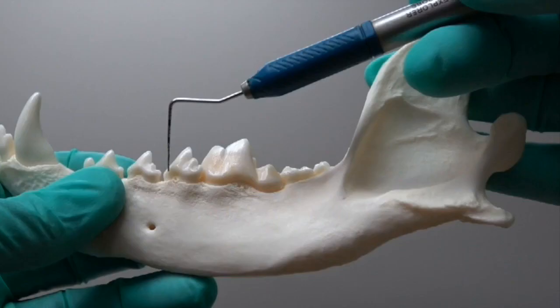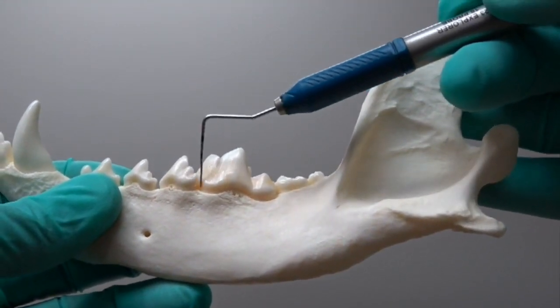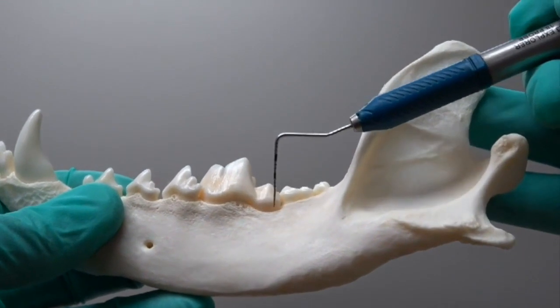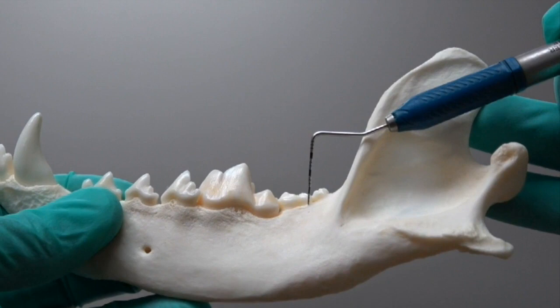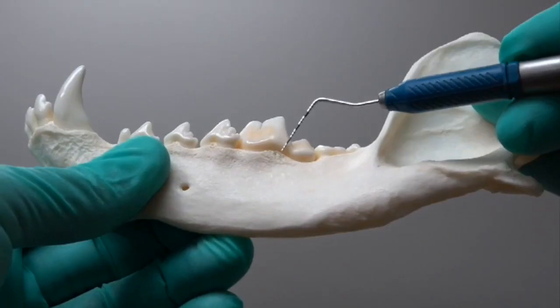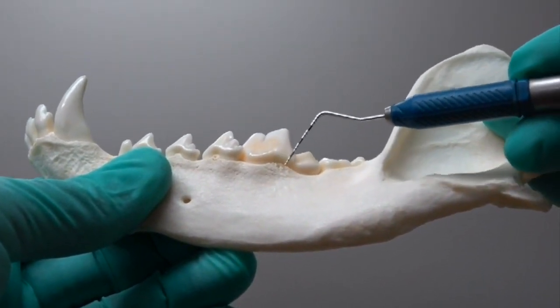For the mandibular first molar, we're going to start at the mesial aspect of the fourth premolar, then little stab incisions back caudally until you reach the distal root of the second molar. For sectioning, the easiest place to go — making sure your identification is correct — is just in front of that distal cusp.